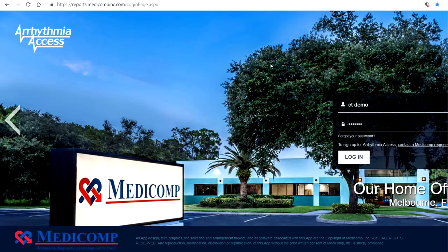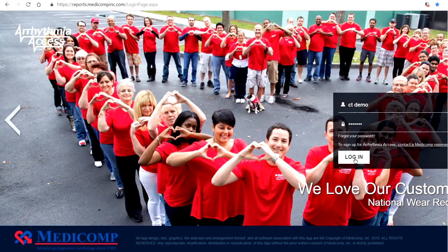You'll go to the Arrhythmia Access website at reports.medicompinc.com whenever you enroll your subjects with Medicomp and when you need to view or print reports. This opening window is your login screen. Take a moment to enter your username and password now if you want to log into the website.